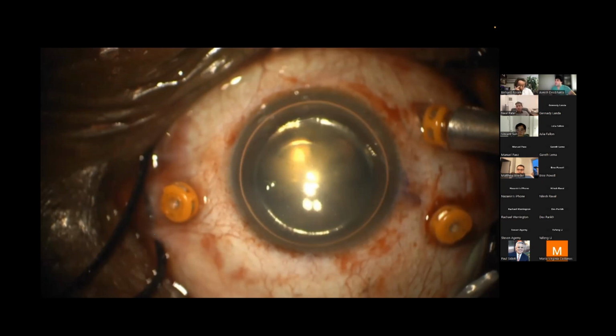You know, Dr. Landa, I've had similar, oh, go ahead. Go ahead. I've had a similar experience. Sometimes an air bubble does help, but with an intact lens, I haven't noticed it that much because it'll push the lens-iris diaphragm back and limit your view, especially to the far periphery. But in eyes where the lens is out, or you can keep the anterior chamber relatively flat, I agree. Sometimes it makes for a better view.